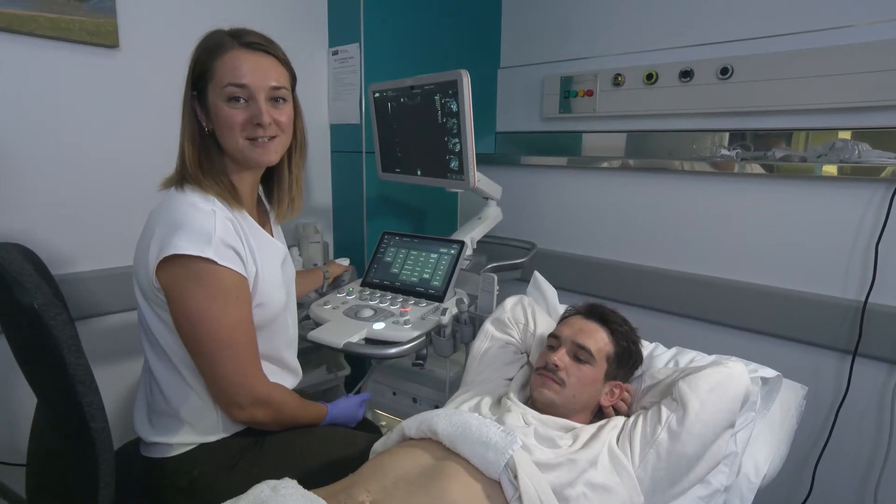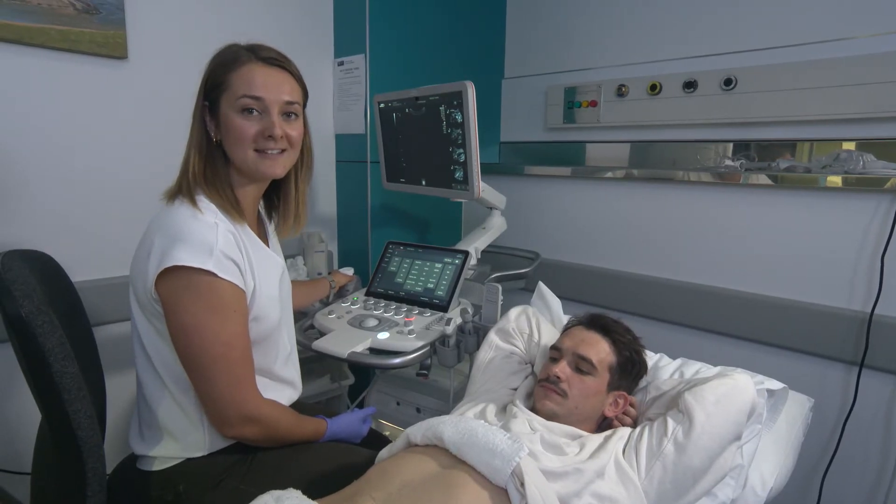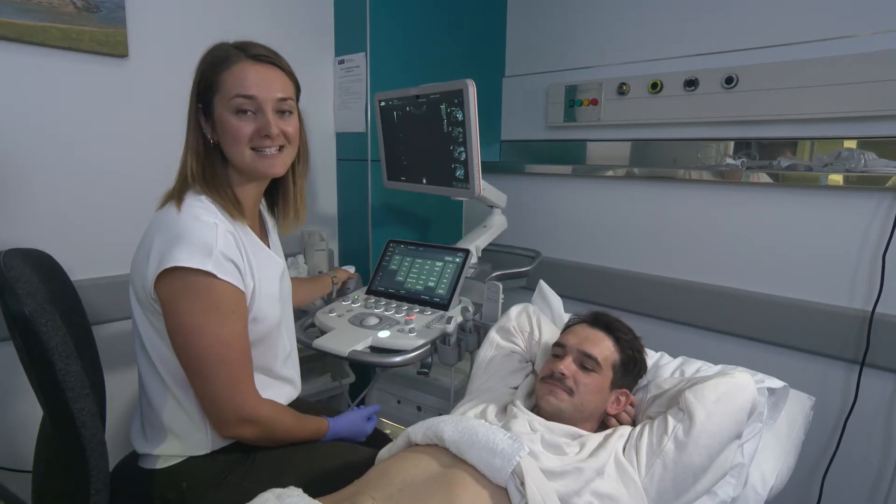Hi, my name is Adriana and I'm one of the sonographers at the University of Auckland. Today we're going to be learning about how to scan the liver. We have our lovely volunteer here, Bruce, who is going to act as a model for us to scan.